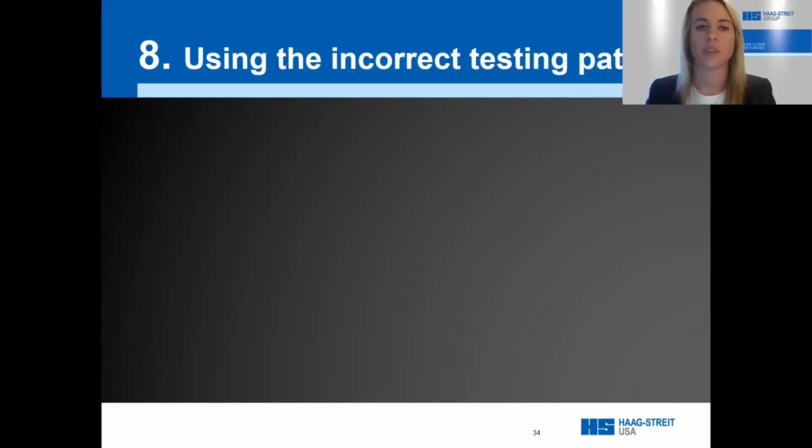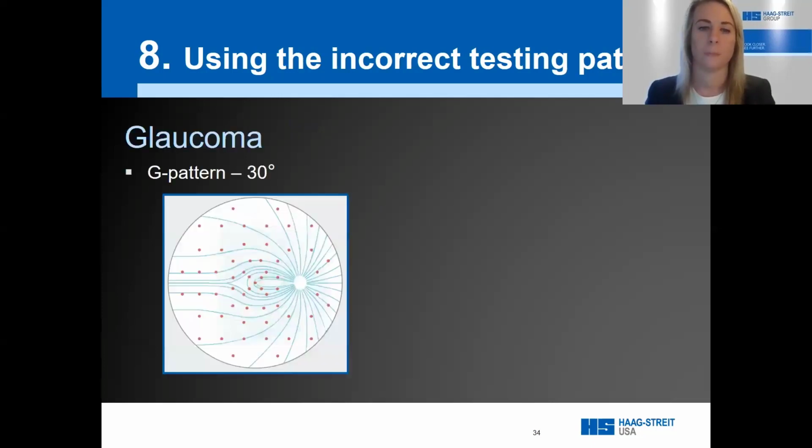As the majority of visual fields do, let us look at glaucoma. We have previously discussed glaucoma defects occur most commonly along the nerve fiber bundles. So how about we test there? The Octopus G pattern does exactly that. It consists of 59 locations within central 30 degrees, distributed in a pattern that facilitates detection of visual loss associated with not only glaucoma, but also neuro and macular disease.